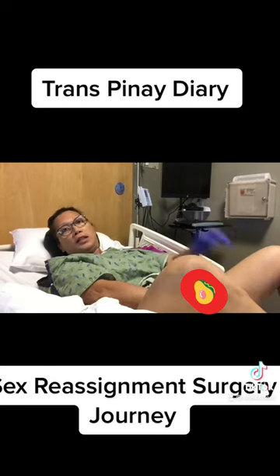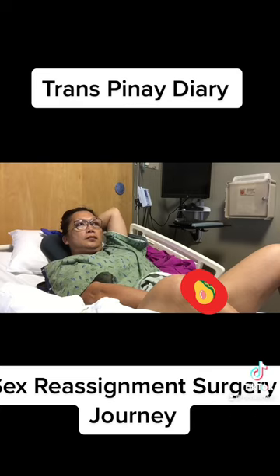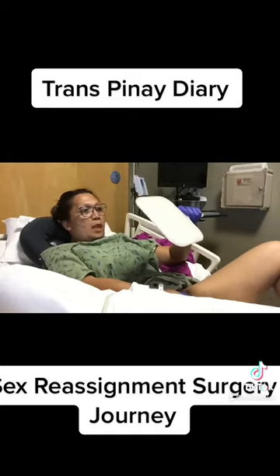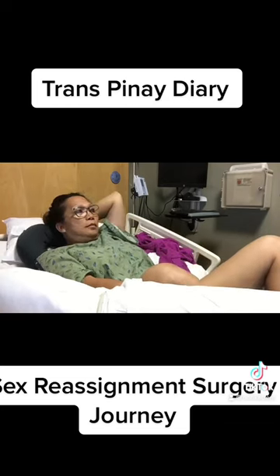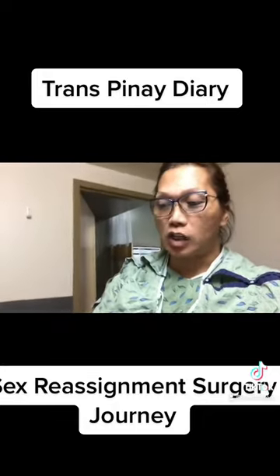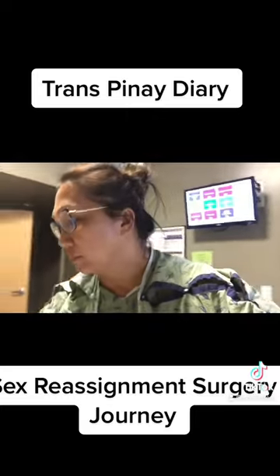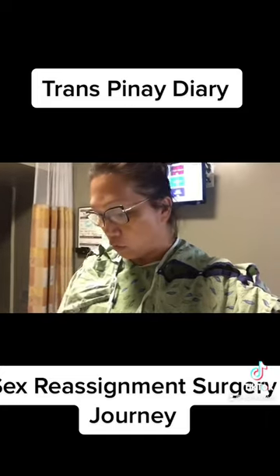I have to do it every day, every three hours for now. Hi guys, now I'm done with my dilation. I washed it and I'm gonna put it back in the case. I dried it with a clean towel and I'll put it back in my case.